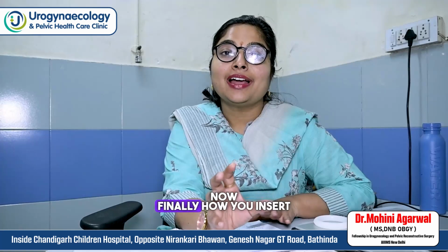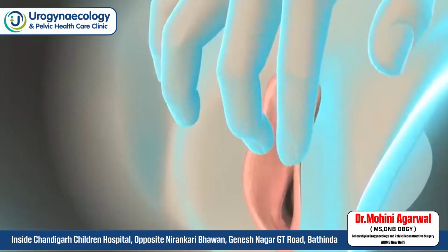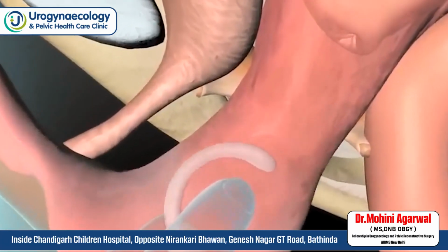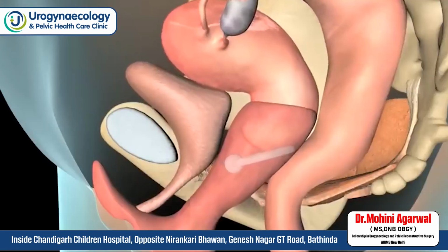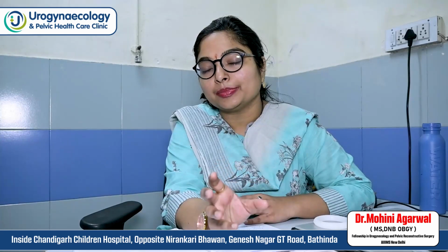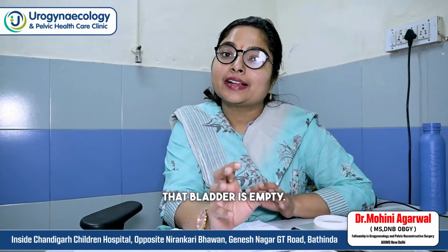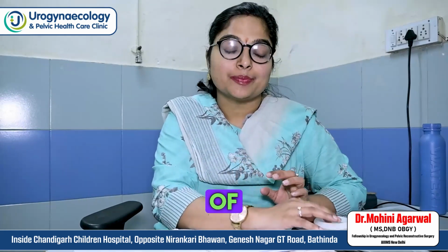Now, finally, how do you insert a pessary? You first of all inform the patient that you are going to insert it, you take verbal implied consent, and then make sure that the bladder is empty. Try to make the bowel also empty. Dorsal lithotomy position, and then the size of the pessary.